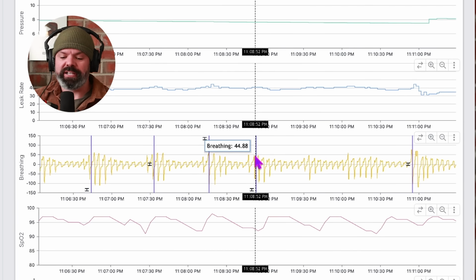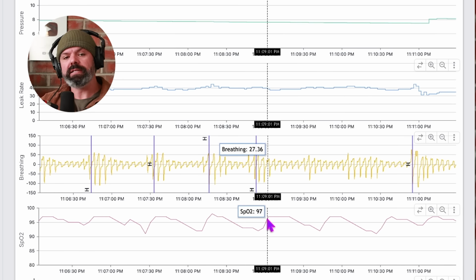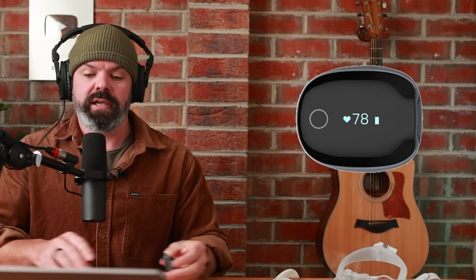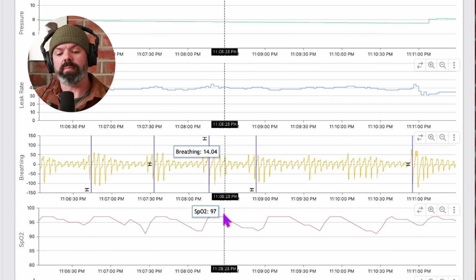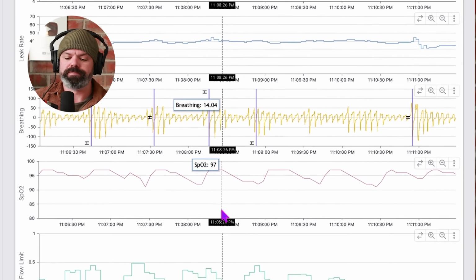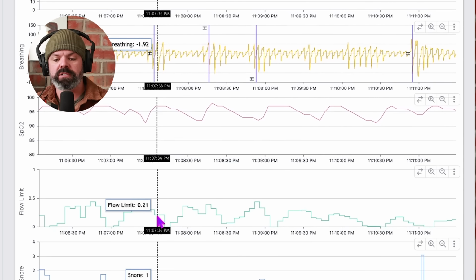And below the breathing chart, we have the SpO2 chart, this pink trace here. And this is Marvin's blood oxygen levels. He wears a Sleep HQ O2 ring here, which is a Bluetooth continuous pulse oximeter. It measures his blood oxygen every 4 seconds. He just puts it on when he goes to sleep, takes it off in the morning, and all this information syncs up with his CPAP data right here on Sleep HQ. Pretty cool. And we've got a few more charts, snoring and so on. We won't go into those right now.